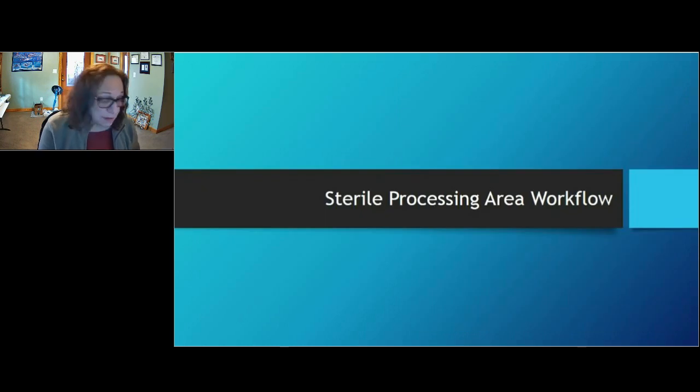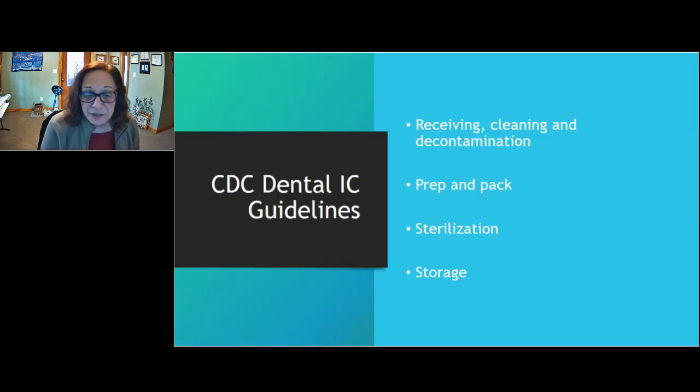Now we're going to talk about the nitty-gritty of sterile processing area workflow. According to the CDC Dental Infection Control Guidelines, the 2003 guidelines, which are the most comprehensive, receiving, cleaning, and decontamination should be one area, separate from prep and pack, sterilization, and storage. These should all be distinct areas within the sterilization area.